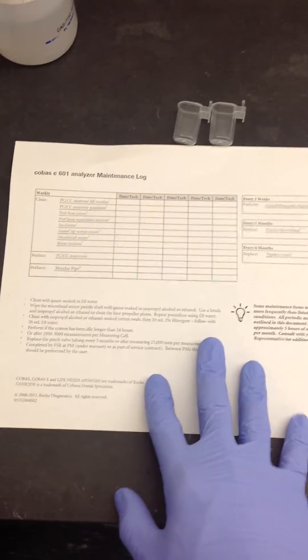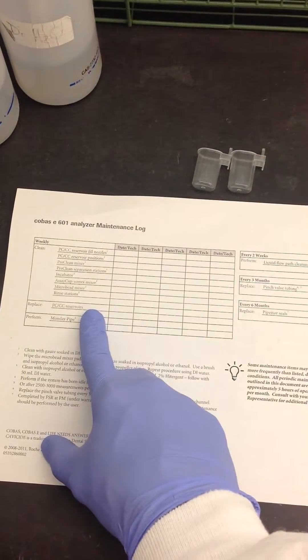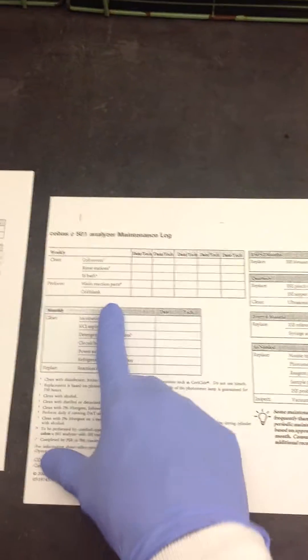Roche gives these out — everyone should have these sheets for their maintenance logs. We're going to be looking at the weekly, that's the 601, and we also have the 501.